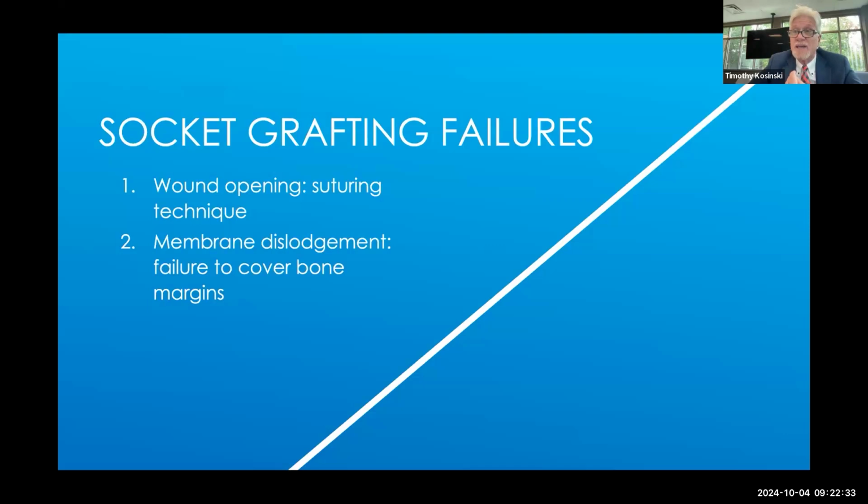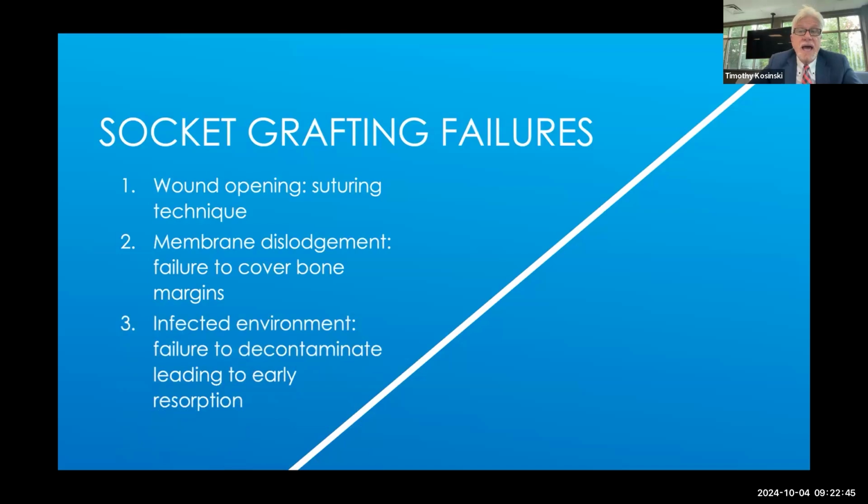I have basically 2 grafts and 1 membrane in my practice, and 1 type of suture with different needles and thicknesses of the suture material itself. If the membrane is dislodged or comes out before 6 weeks, the case becomes unpredictable. It may work, it may not. So we'll demonstrate that.